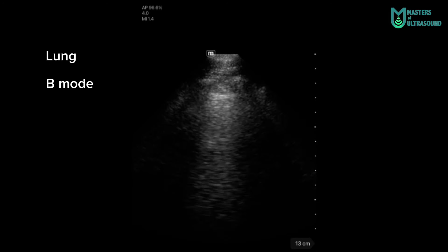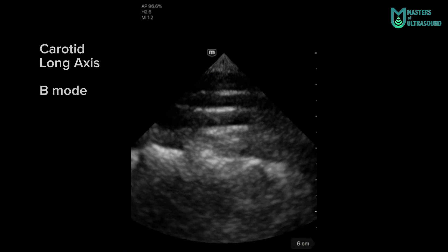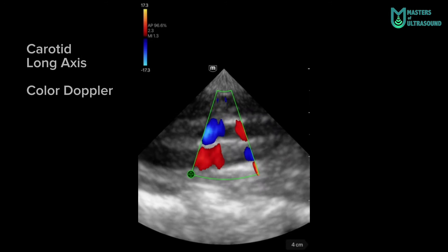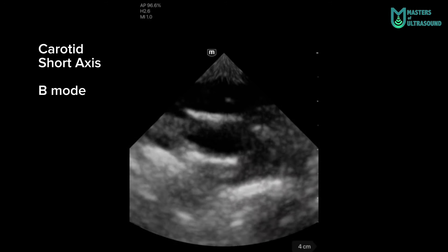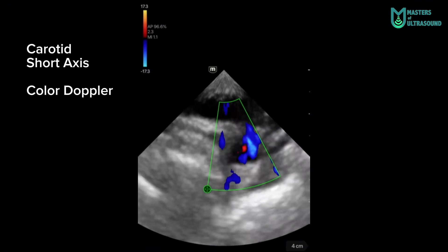Here is a lung without B-lines — just A-lines, which are artifacts. I also wanted to include this carotid long axis, even though this device is not designed for these shallow images because of the frequency requirements of the probe. The image quality is not terrible, but this is a pitfall of a dedicated probe — you simply cannot scan the entire body with the same probe.